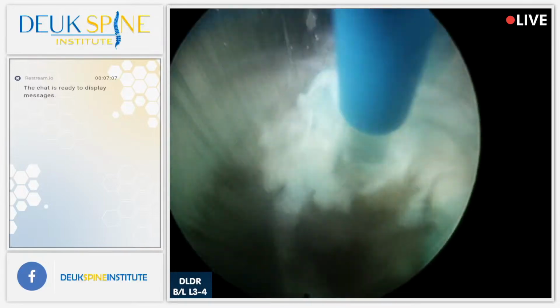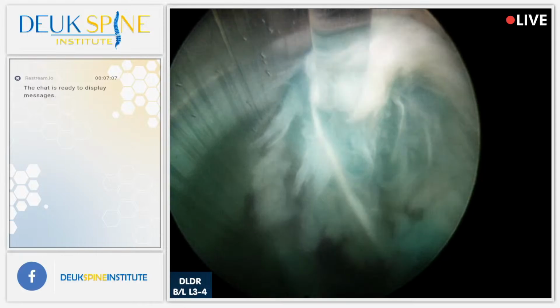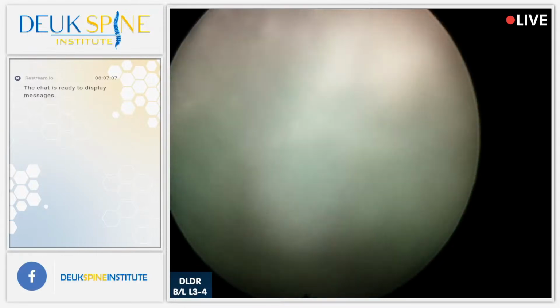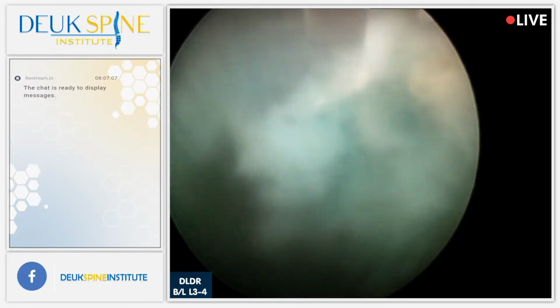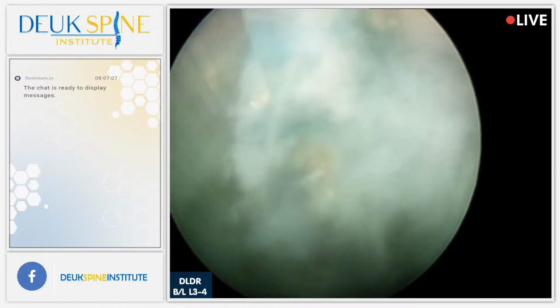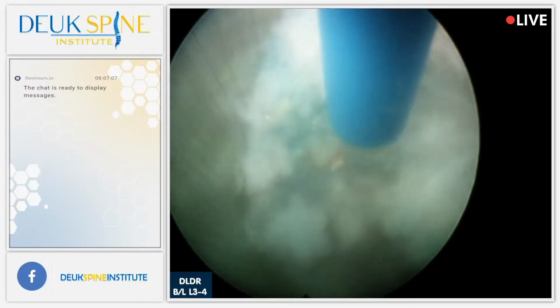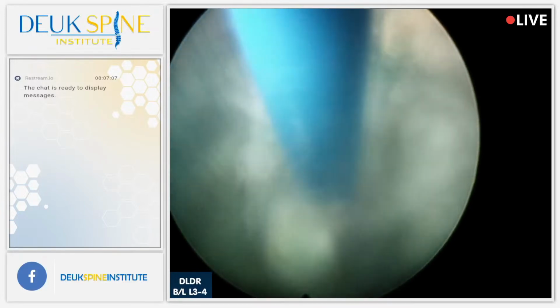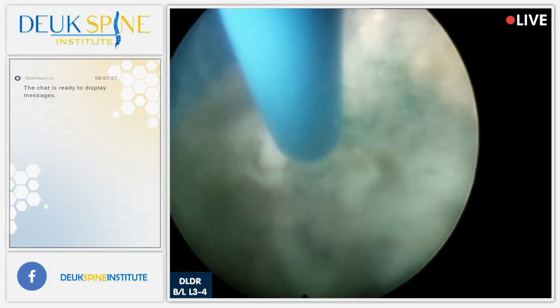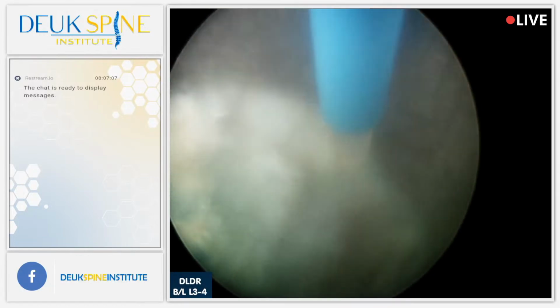And you can actually see the tear right here, folks. Look at that annular tear. That's the tear in the annulus right there. And that blue stuff is the herniation stuck in the tear. This is what causes all the back pain and leg pain. It's called the interposed herniation. Most spine surgeons don't even treat this. 99% of them won't treat this because they don't know that this is the cause of back pain. I've been trying to tell them for 16 years. They just don't listen.